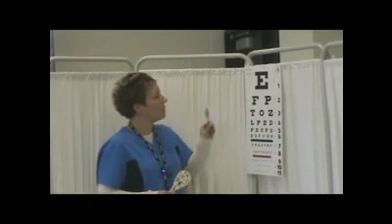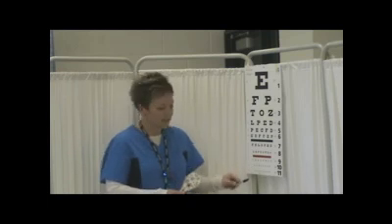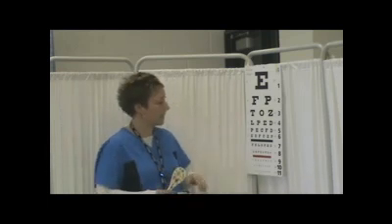We're going to go over the Snellen chart, which is what we use to assess visual acuity. It's important to have the client 20 feet away from the Snellen chart, and that's what we're assessing at. In the school environment, for example, most of the tiles used are 12 inches long, so you can use that and count out 20 feet.